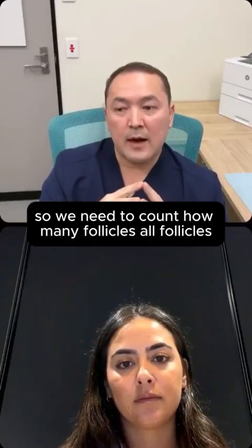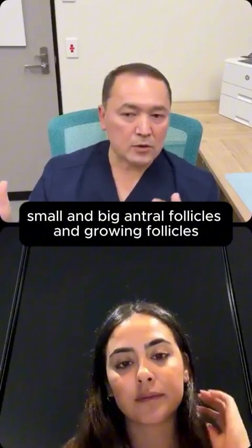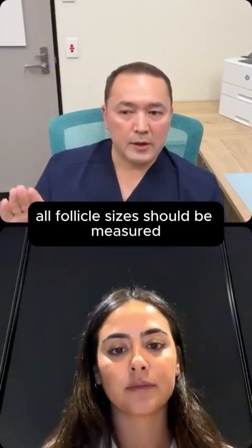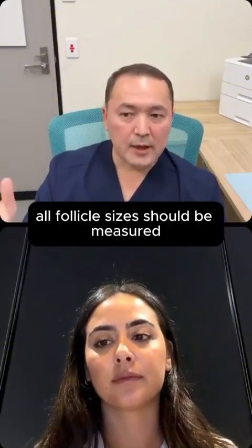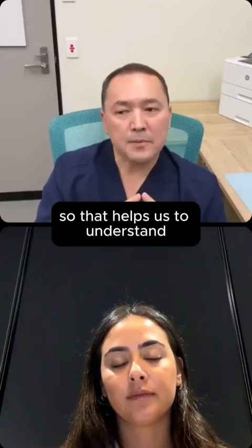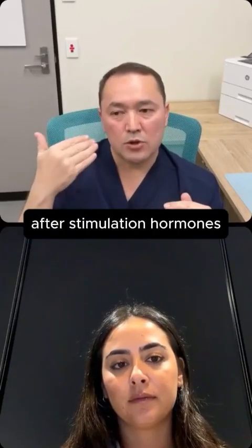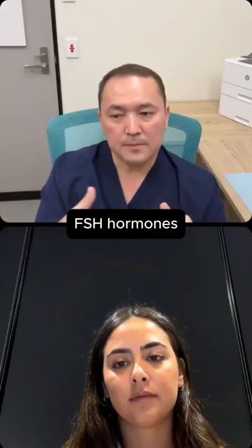So we need to count how many follicles, all follicles, small and big, antral follicles and growing follicles. All follicle sizes should be measured and then we plot them on the chart, on the right and left ovary. That helps us to understand how many follicles got activated after the stimulation hormones, the FSH hormones.